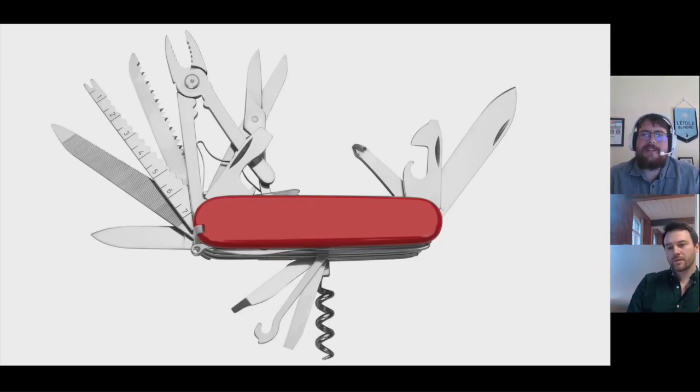If we're looking at scaling this and we want to create thousands of patient-specific models, then maybe we need to look a little more in the direction of stereolithography with the RPS solution, or selective absorption fusion, building cutting guides out of nylon 11 or nylon 12, where we can print thousands of these cutting guides. Most geometries are going to work in this case. 1,000 a day is just an insane number. So again I go back to the Swiss Army knife.